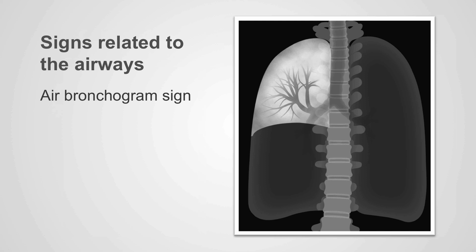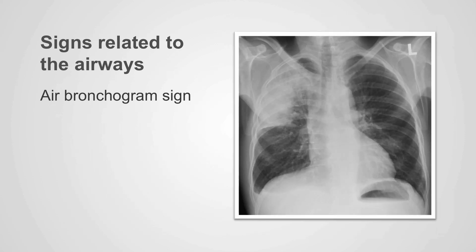This is called the air bronchogram, and depending on the clinical situation, air bronchograms can be caused by pneumonia, pulmonary contusion and bleeding, pulmonary edema, or occasionally bronchoalveolar carcinoma or lymphoma. In this example, we see opacity within the right lung, and within that opacity we can identify branching tubular black structures representing the patent bronchi in this patient with a right upper lobe pneumonia.